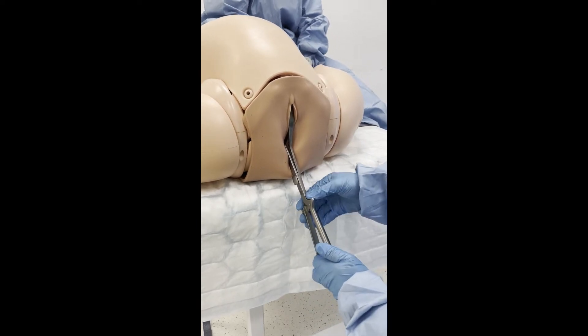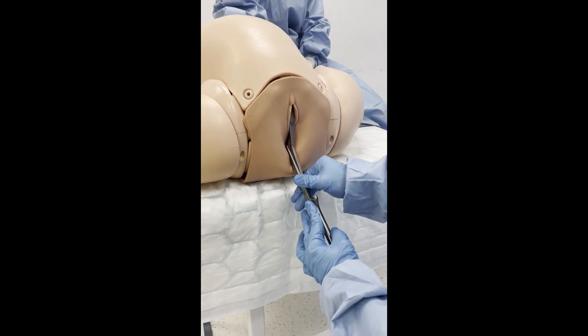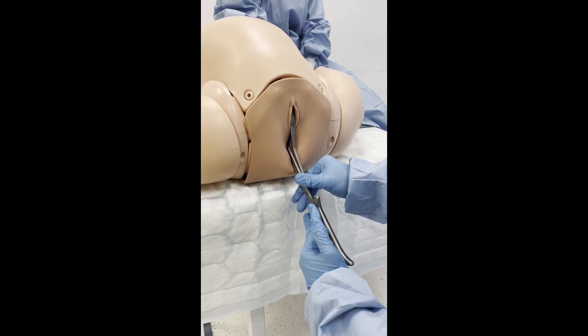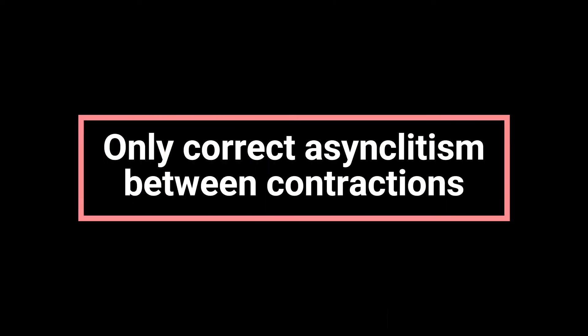Asynclitism is corrected by the operator pulling the finger guard nearest the perineum towards themselves, while simultaneously pushing on the opposite finger guard. This is done until the handles are aligned, and is only performed between contractions when the uterus is relaxed.